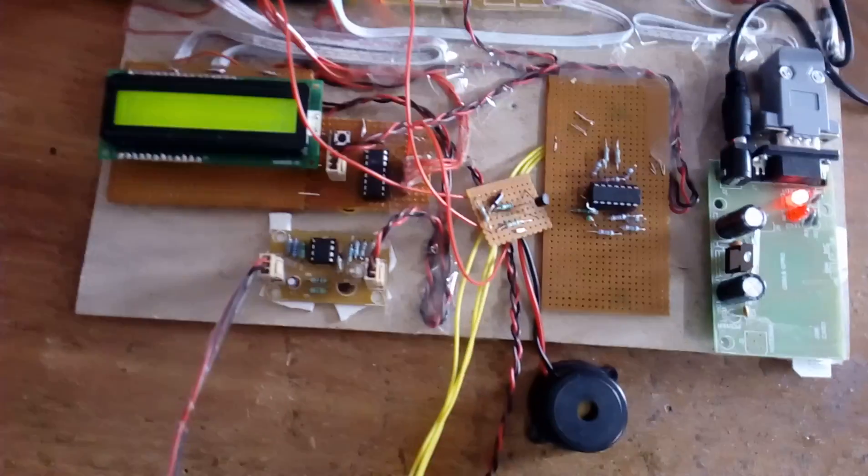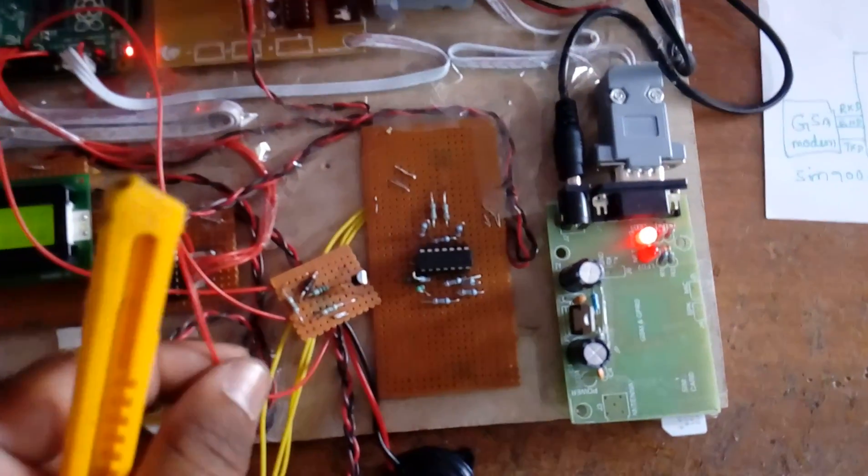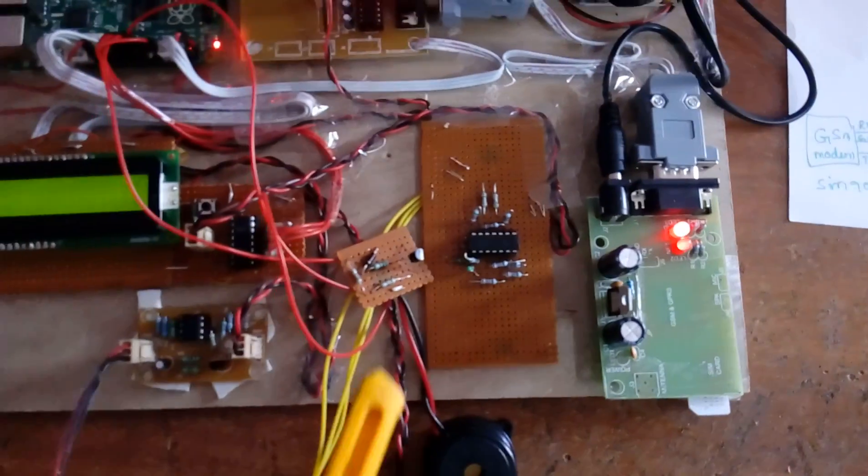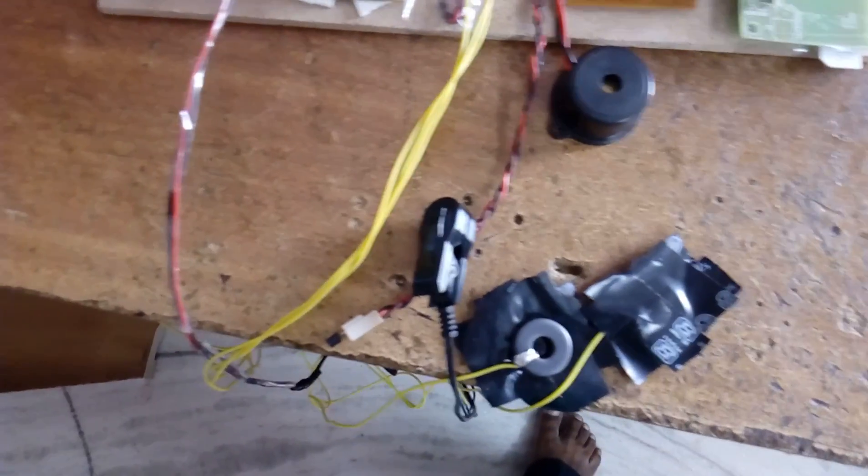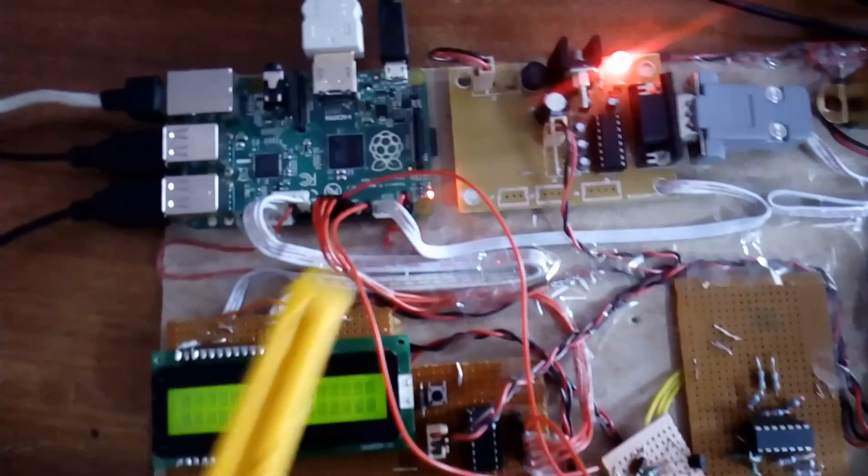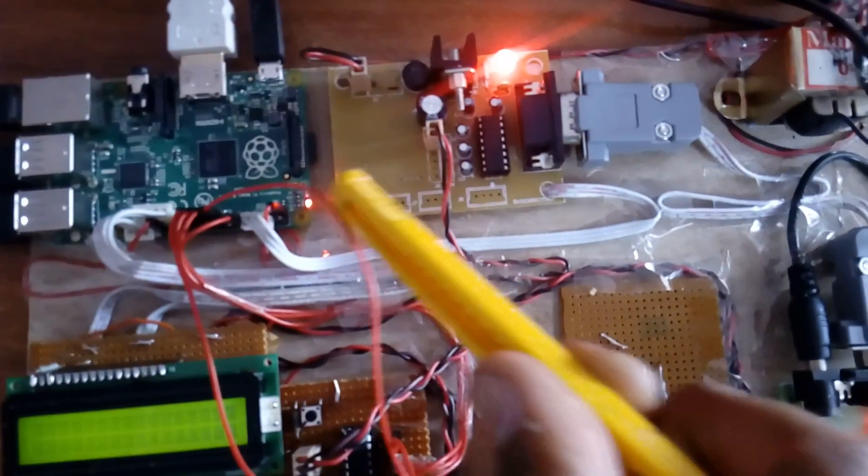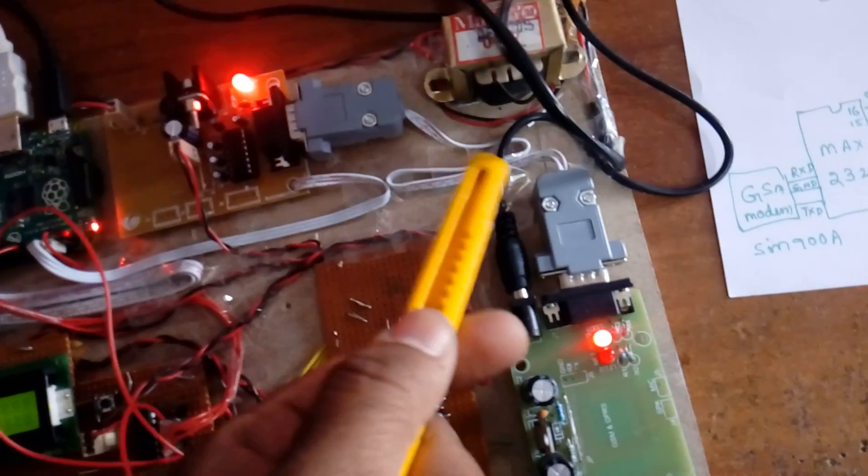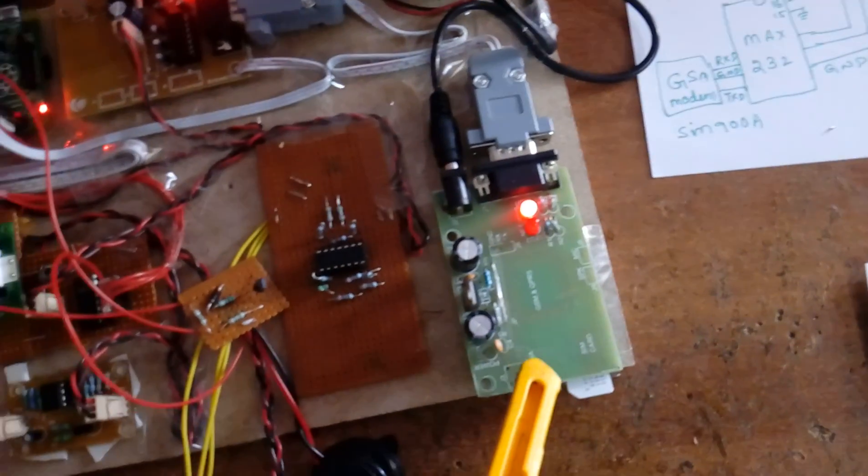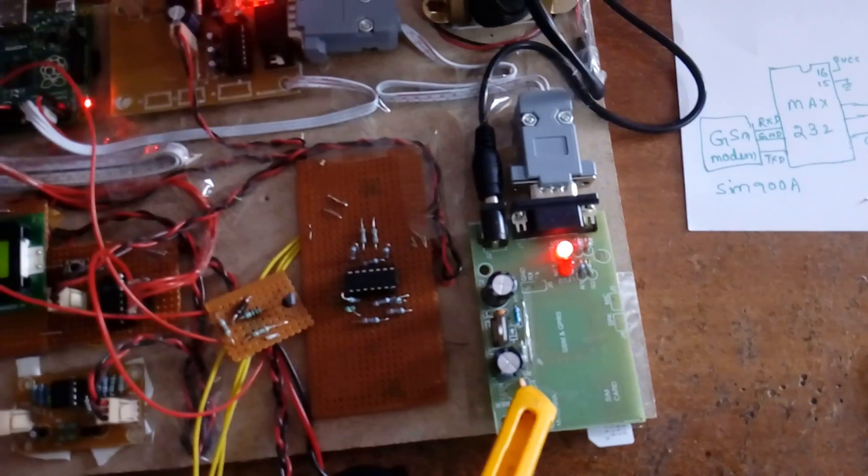I am using one LM324 based ECG module and one alarm circuit. These are the normal probes and one MAX232. It is connected to the RX TX, and here this is an RS232 cable and this is GSM SIM 900A.